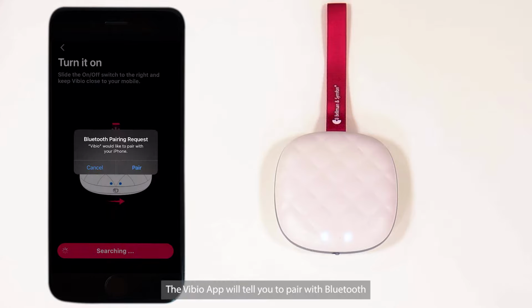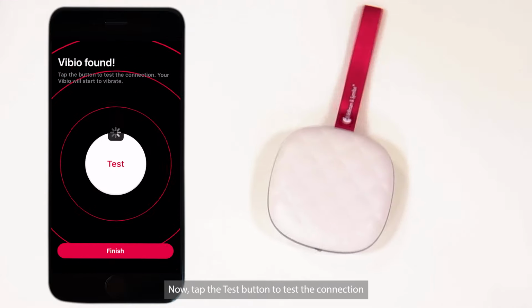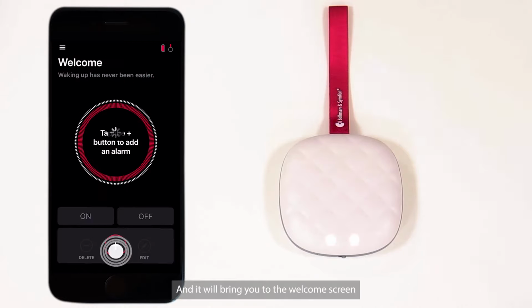The Vibio app will tell you to pair with Bluetooth. Make sure the Bluetooth on your phone is turned on. Now press Pair. Then Vibio is found. Now tap the Test button to test the connection. Now that Vibio is paired successfully, press Finish, and it will bring you to the welcome screen.